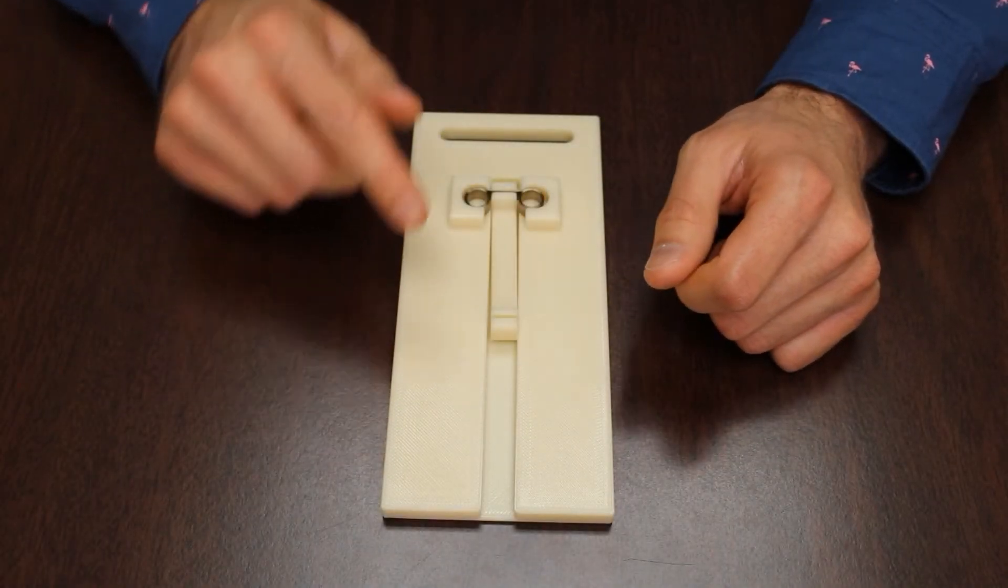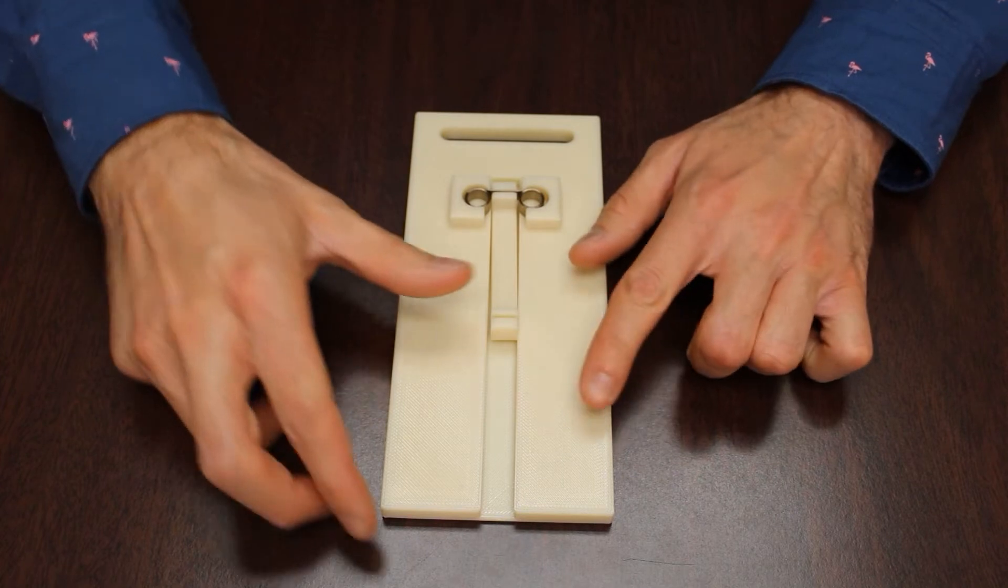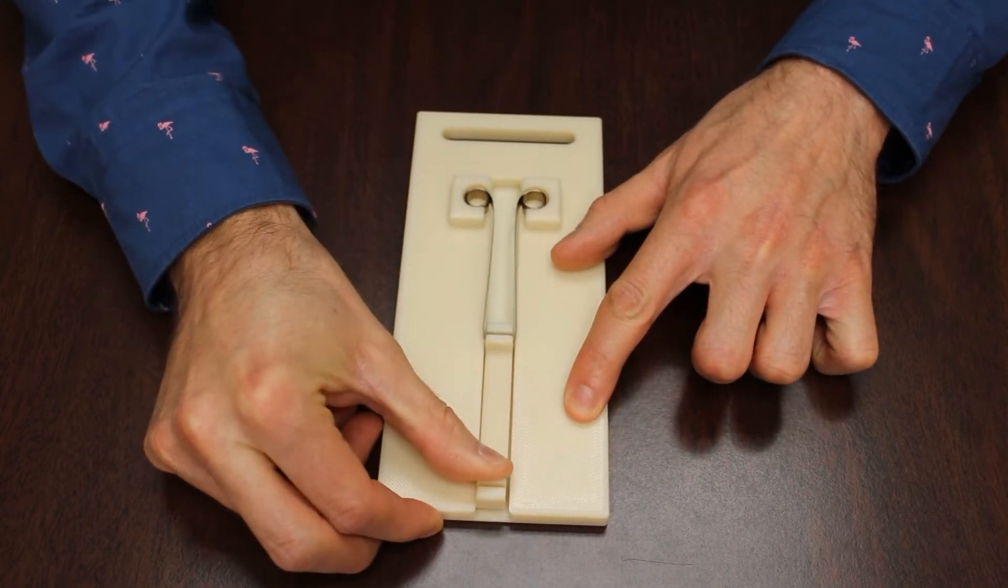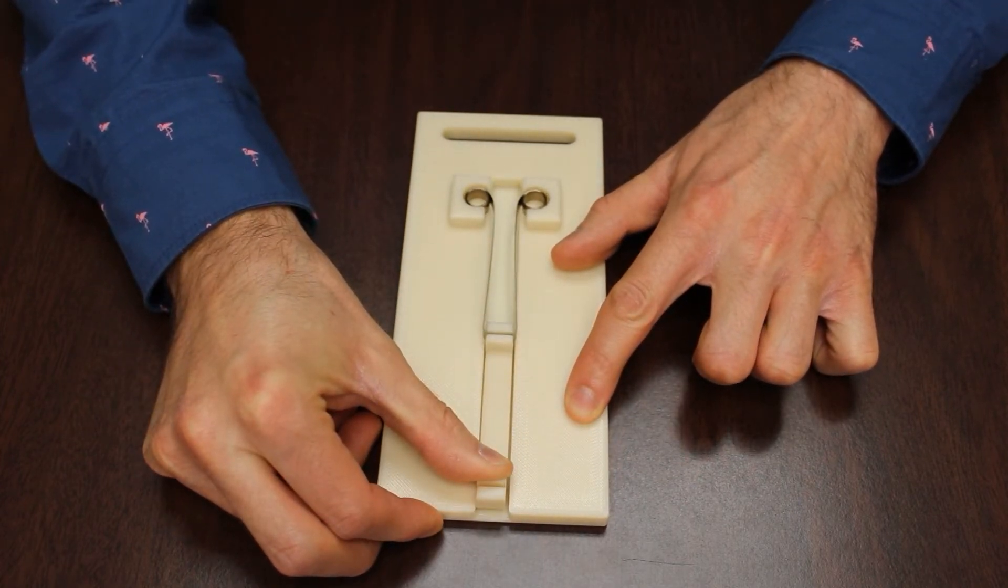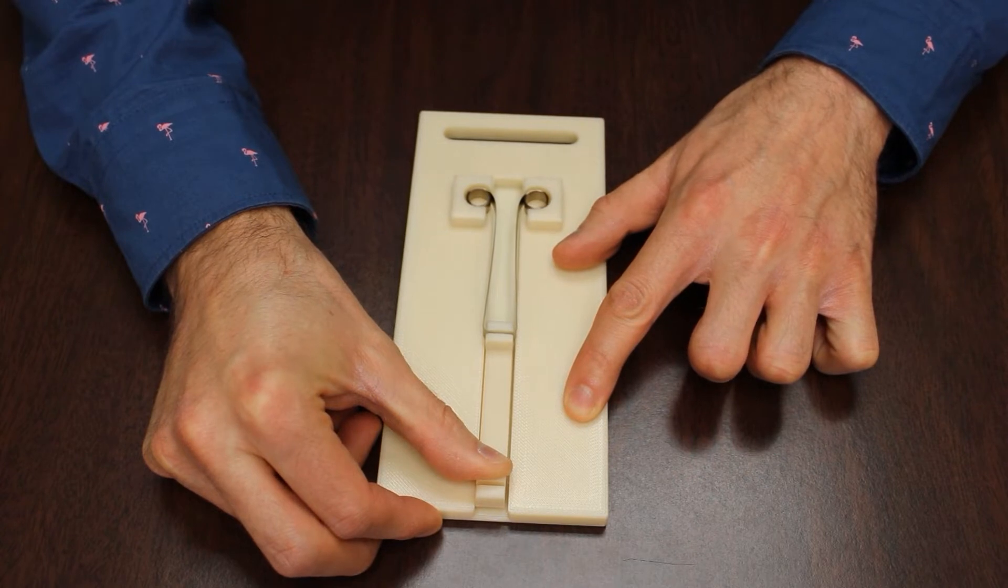When the center portion of the spring, called the saddle, is extended like this, the spring coils exert a force to retract the spring, like this.